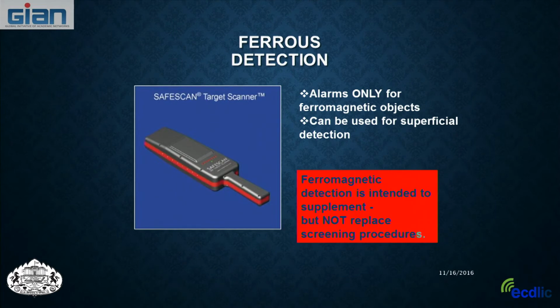You'll always need to ask the person and go through a checklist with them. These checklists are usually designed by the center and a safety officer to screen them completely for metal. And sometimes we ask multiple times. In fact, we scan our same participants 4 times. Every time they get in the scanner, they have to go through this checklist again and provide their signature confirming that they don't have any of these things in their body.